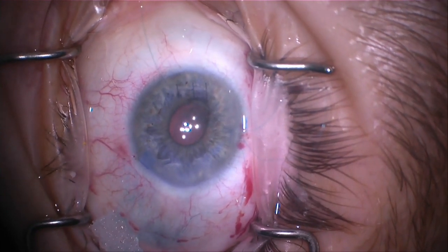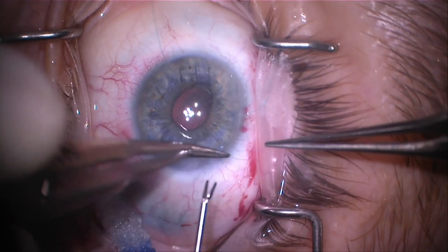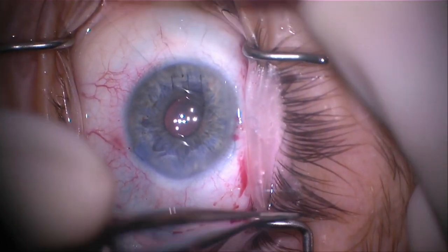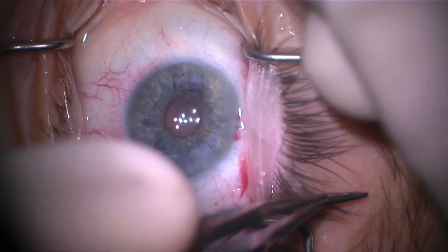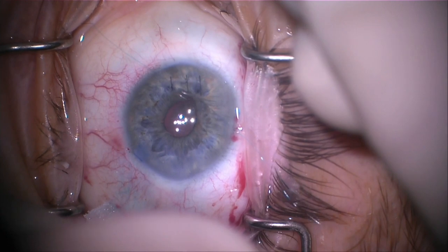You'll see a lot of instruments on the eye as I'm explaining to the resident how to do this case. This is the first pass — remember, it's a 2-1-1. So two suture throws, pull the loops through the free end of the suture, grab both ends. As we pull on both free ends, the knot gets pulled into the eye, and magically we'll see that iris defect re-approximate. There it goes. That is the first of the throws — usually we do three; it's a 2-1-1 knot.